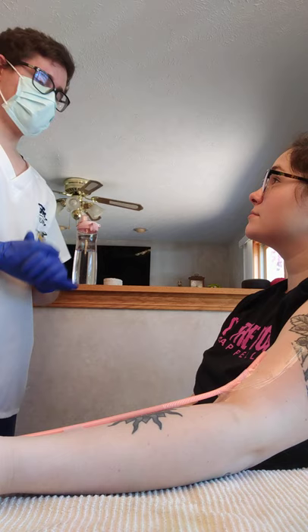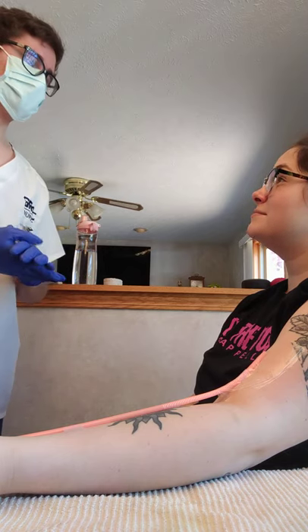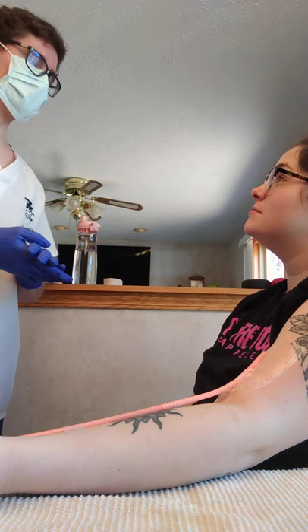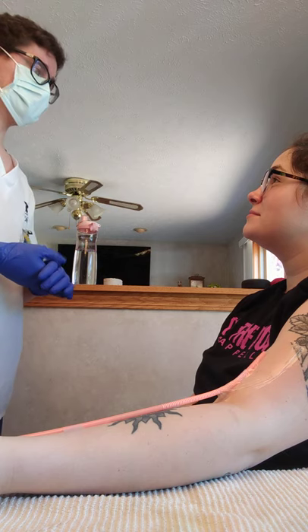Hi, my name is Ian. I'm going to be your nurse today, and today we're going to do a dressing change on your catheter, and then I'm going to flush and put in a new locking solution into your catheter. Does that sound good? Yes. All right, to start off, can you tell me your name and date of birth?